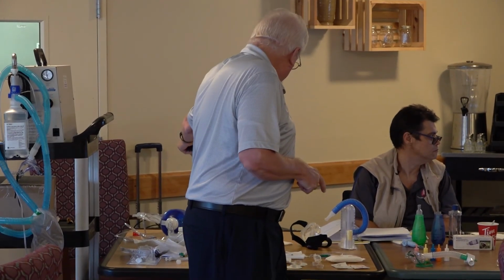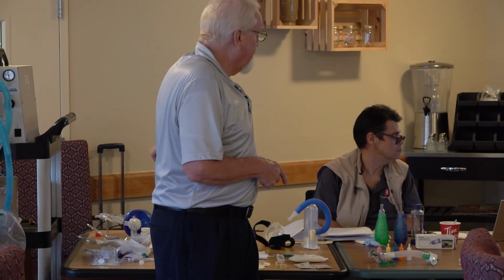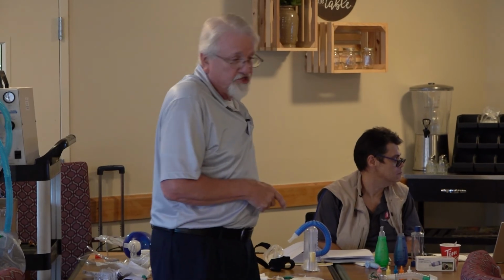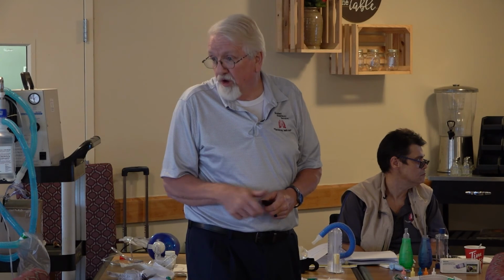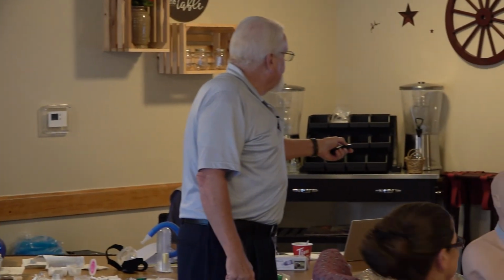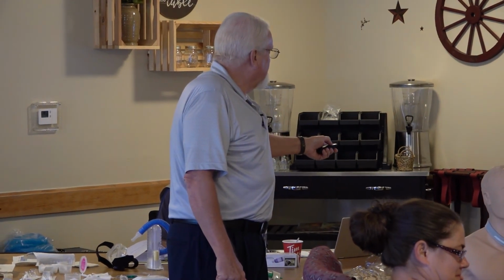Let's see. Any questions about anything there? We're good? The oxygen, again, for this you're going to have that hooked up to your tank, okay? Not the concentrator. I mean, a concentrator will do, push come to shove, but you would prefer to have that hooked up to a tank where you can open up the flow, okay?